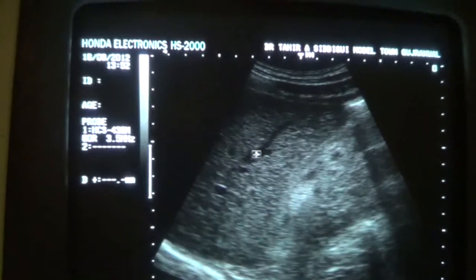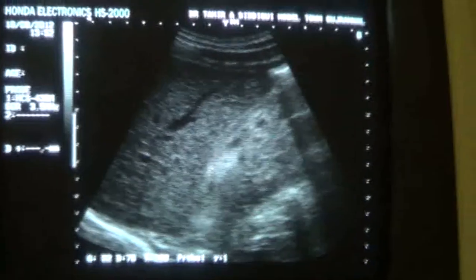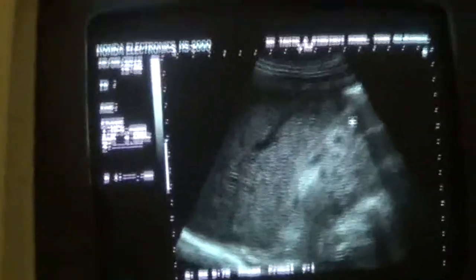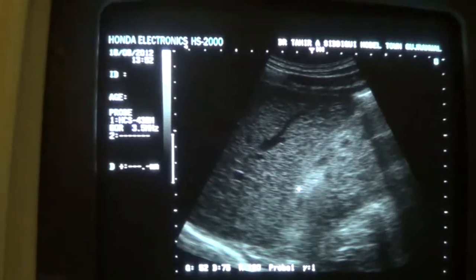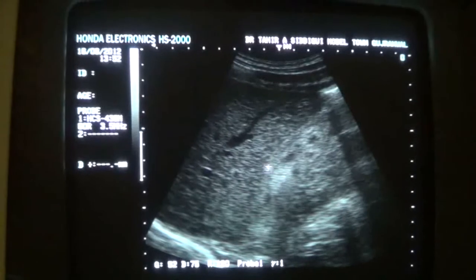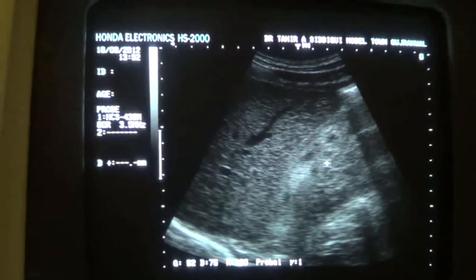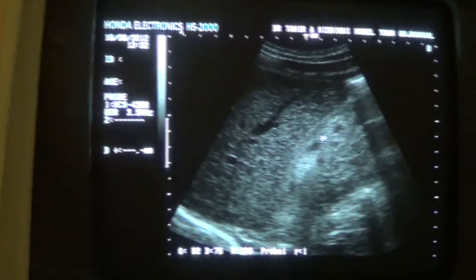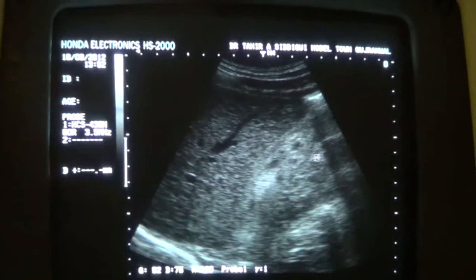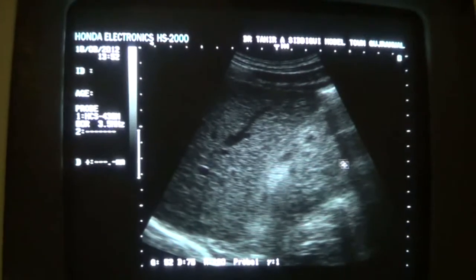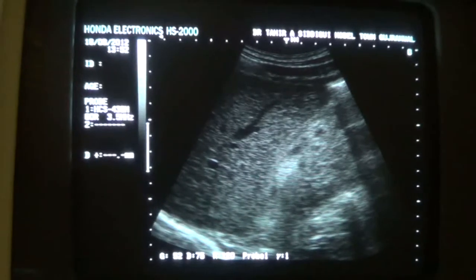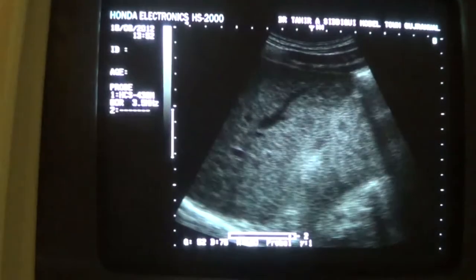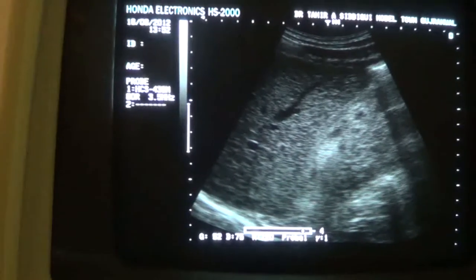Comparing the brightness or echogenicity of the liver with that of the right kidney's parenchyma — this is the parenchyma — the parenchyma echogenicity is clearly raised. The dimension in anterior-posterior diameter is small. The outer capsule is muffled. There are tiny cystic areas within the medullary region, which are pyramids, and there is no sinus echo complex. This is in fact a case of grade 2 renal parenchymal disease.